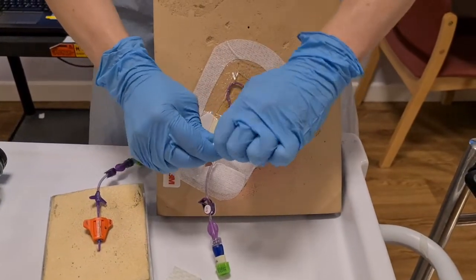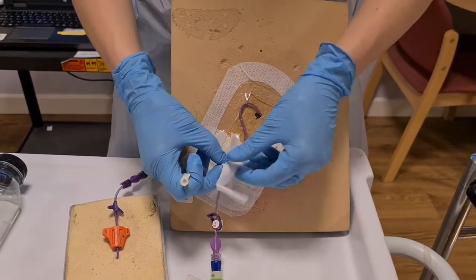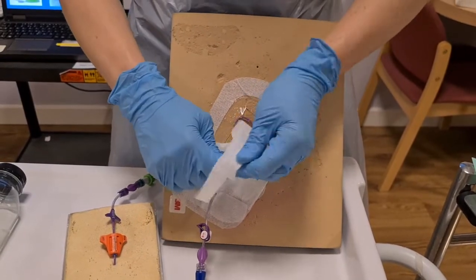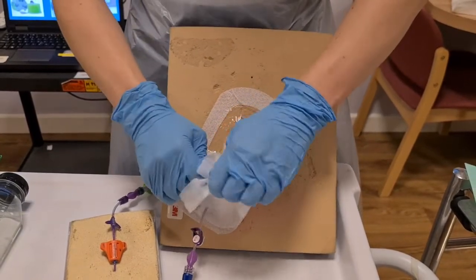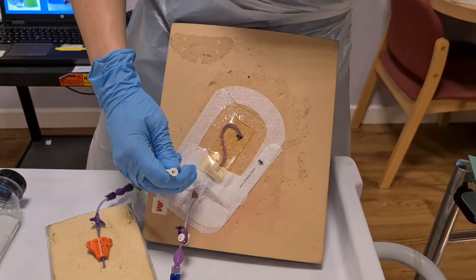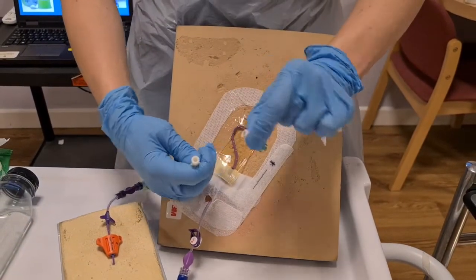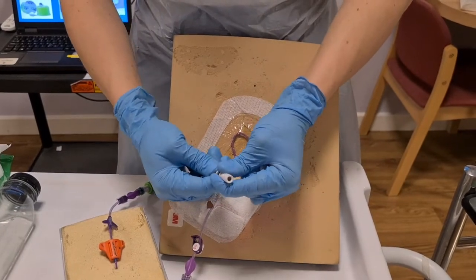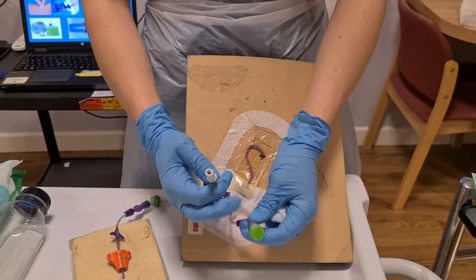To change the Bionector, you completely remove your Bionector, and you pick up the new one and open it all the way up, giving it a really good clean using different parts of your wipe. There we go. Then still using non-touch technique as much as possible. So either side of my Bionector is a key part. So placing on the Bionector like so.